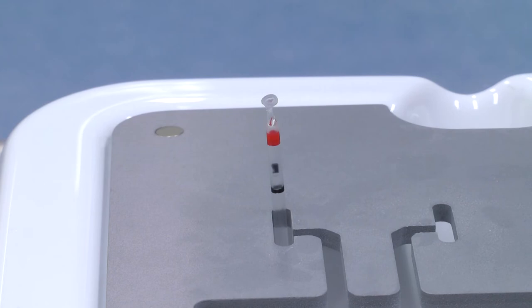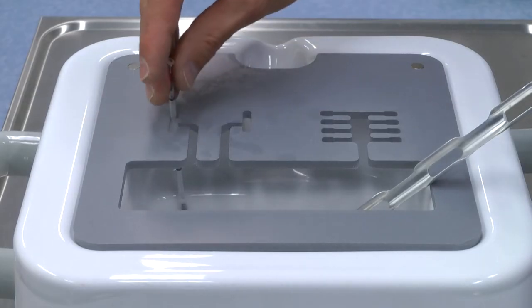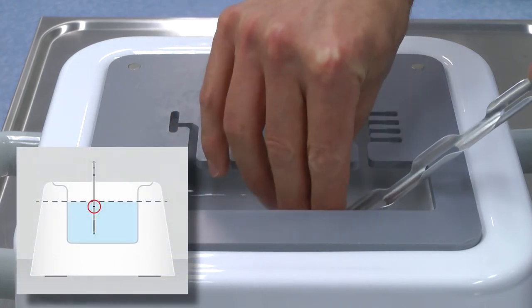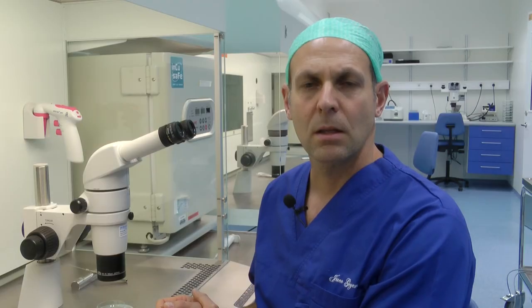When you've finished, inspect the seal to make sure it has been performed correctly. You can now move the sealed straw into your cryocane. The lowest black mark of the RapidStraw must always be submerged in liquid nitrogen. The cryocane can now be transferred to your long-term storage tanks according to your own protocols.